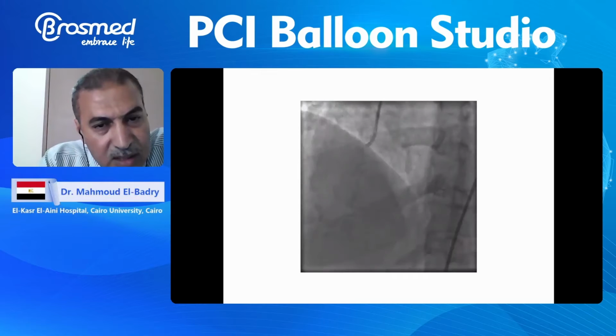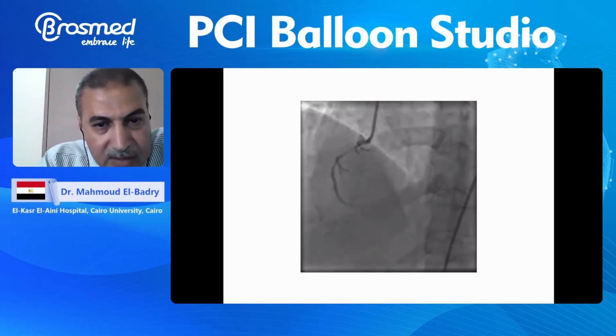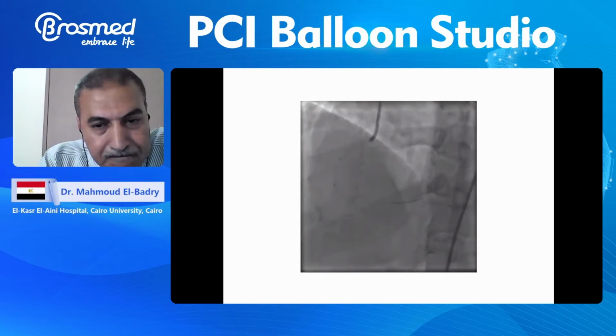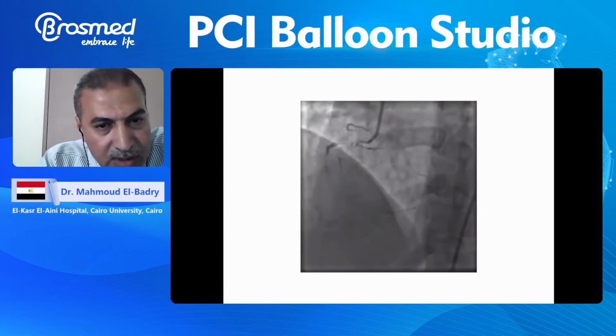And as you see, that's a long lesion, a long total occlusion segment, and a larger balloon dilatation was done.